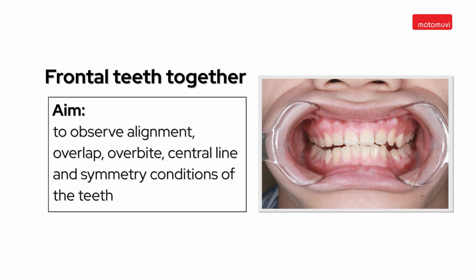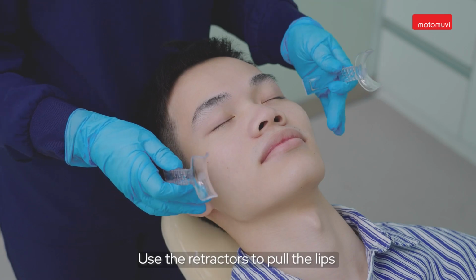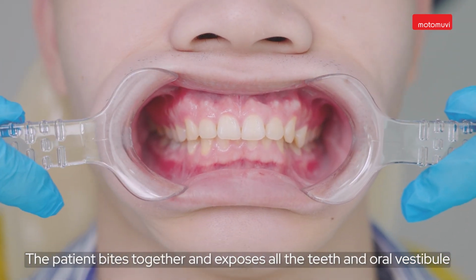Frontal teeth together to observe alignment, overlap, overbite, central line, and symmetry condition of the teeth. Let the patient lie on the dental chair, which makes a 30-degree angle with the floor. Use the retractor to pull the lips. The patient bites together and exposes all the teeth and oral vestibule.